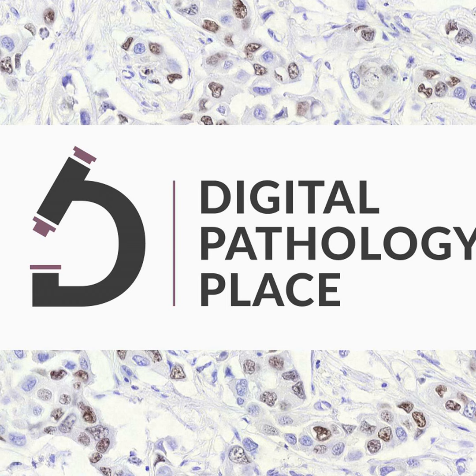You do the first biopsy and then you have the results that are telling you that there's no cancer or inconclusive or low. There is a specific Gleason score for that. And that's active surveillance. You don't do prostatectomy, you don't treat, you just monitor. And what happened here, they use an AI algorithm, which to me it was like, okay, well, we even have an AI algorithm that is cleared by the FDA for prostate. So that's kind of not that novel.